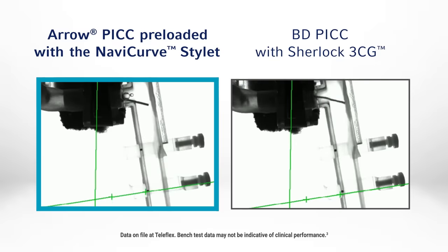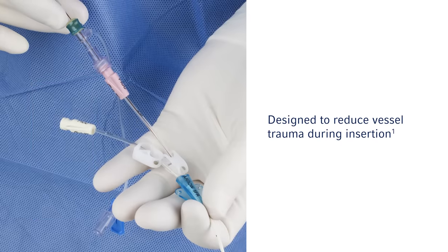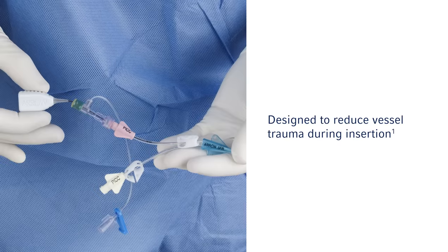In an in vitro study mirroring difficult vasculature, the Arrow PIC preloaded with NaviCurve stylet outperformed the BD PowerPIC catheter with Sherlock Tip Location System stylet in reaching the SVC without withdrawal, reinsertion, or any other troubleshooting mitigation techniques. Greater first attempt success means more than just efficient PIC placement — it also protects the patient's vasculature.